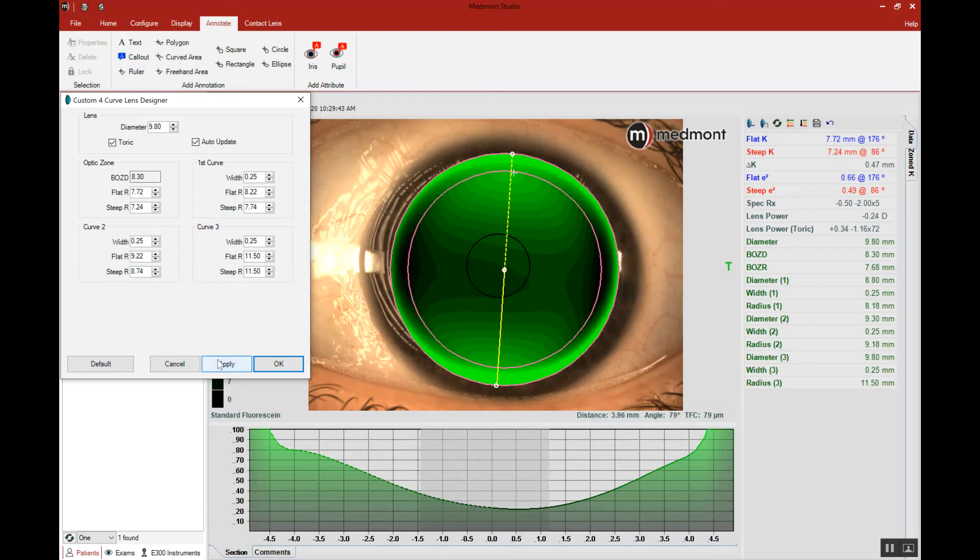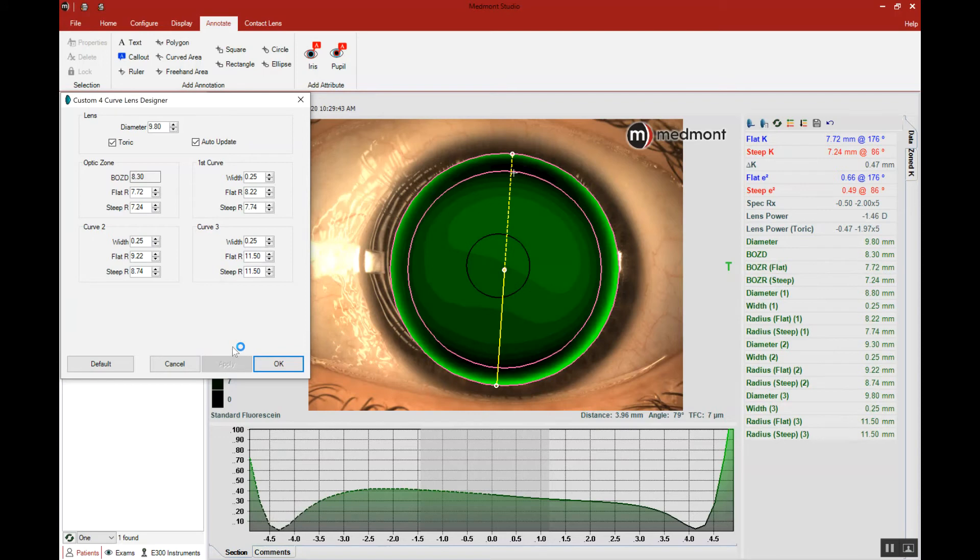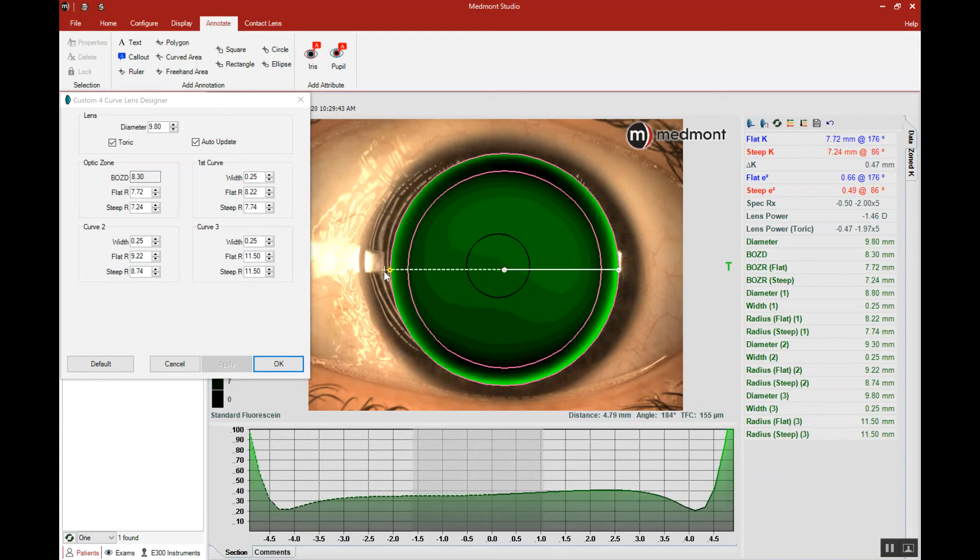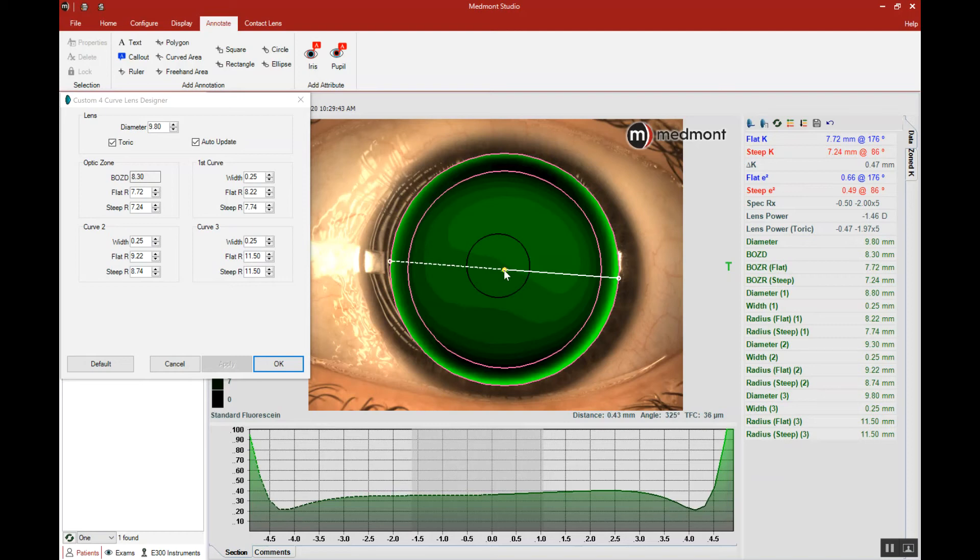Now we'll apply and drop that toric lens on eye, and then let's look at whether we have that good horizontal alignment across the flat meridian. Notice with the toric, our lens now has too much apical clearance and it lacks the landing at three and nine o'clock. Well, let's first start with apical clearance.